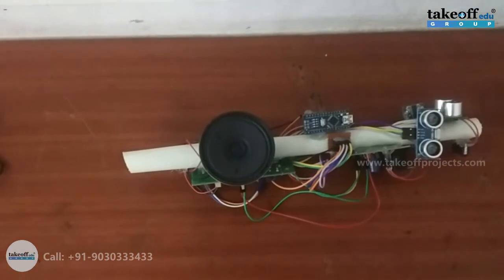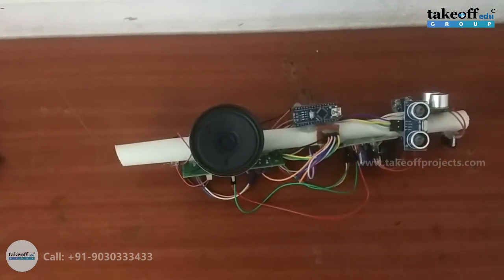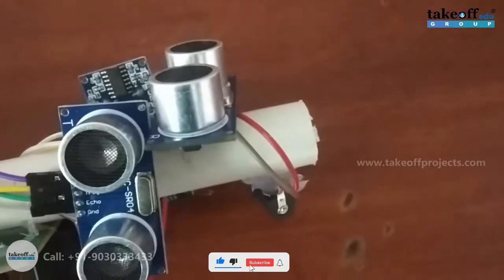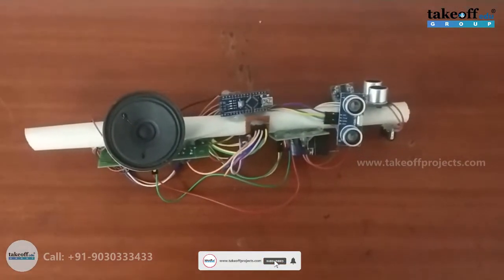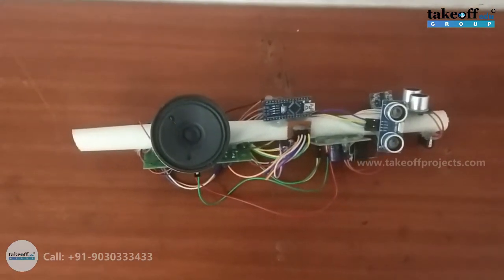Hello, everyone. The project name is Multifunctional Blind Stick for Visually Impaired Person. Here we are having three ultrasonic sensors to find obstacles in the path. And when an obstacle is found, regarding that direction, the voice will be activated.